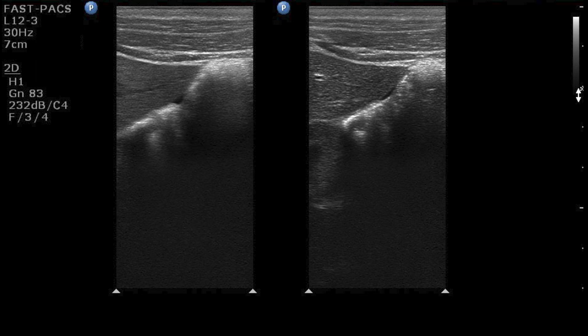As we scan through, we find just a very, very trace amount of free fluid under the caudate lobe of the liver. So the next question is: technically we have a trace amount of free fluid — what do we do? Because technically it's a positive study. The patient was in an MVA with abdominal tenderness and a technically positive FAST. But is this amount of fluid indicative of pathology, or could it be within the normal scope of things?